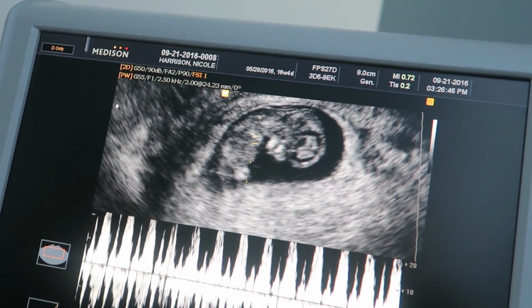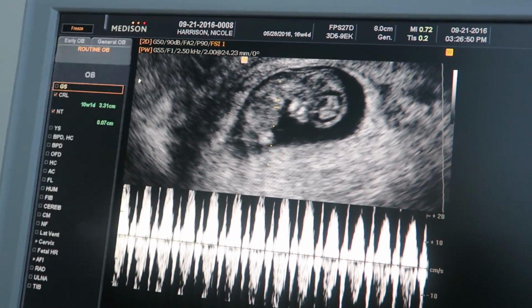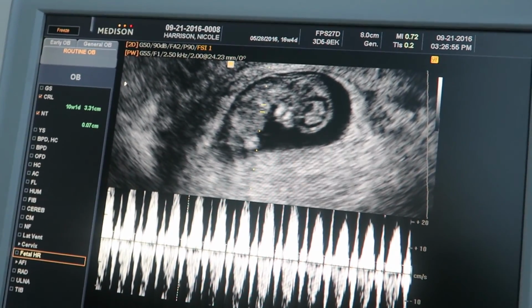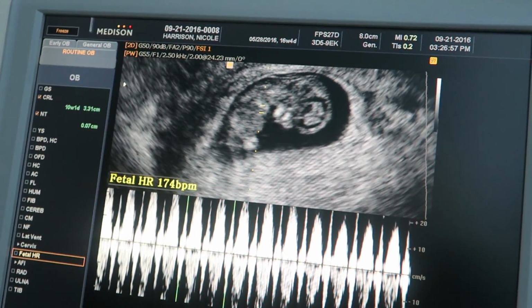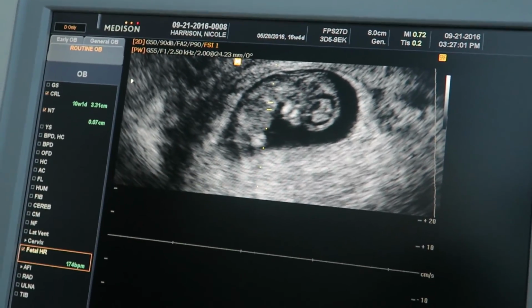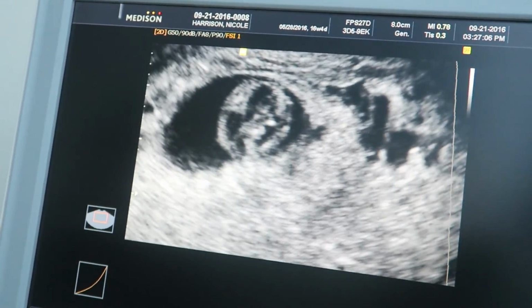That's fascinating. Who is that, Brenda? That's your little sister. So that shows a normal rhythm. And then her heart rate is 174 beats a minute. Absolutely normal. See, she just said her heart rate. For good luck.